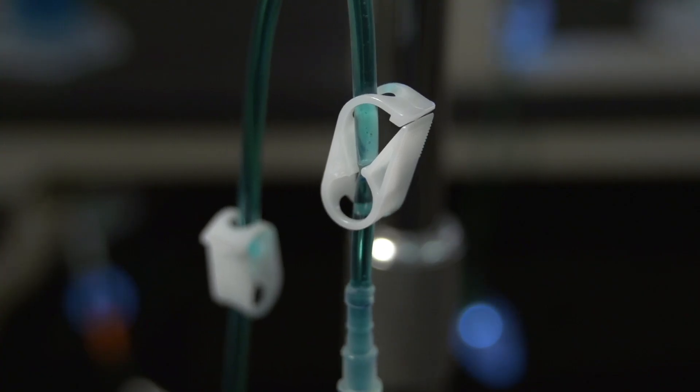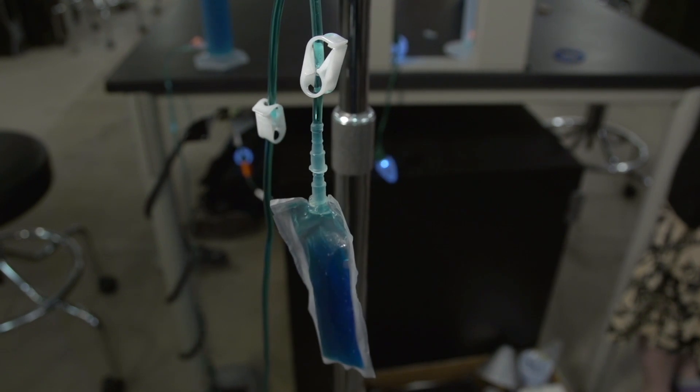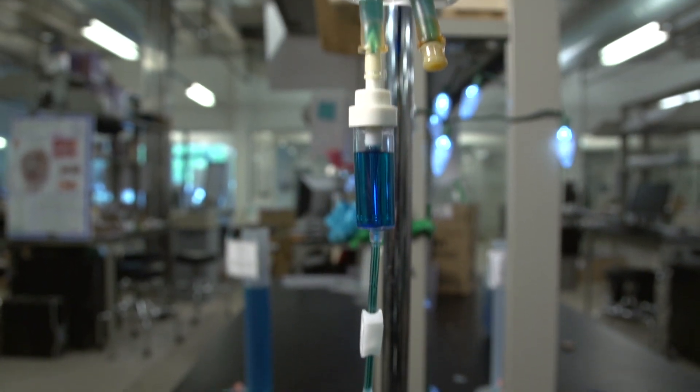We've designed the Easy Flush IV tubing set. It's modified standard IV tubing which a person would need if they're receiving IV fluids or medication, and we've added three pinch clamps, a Y connector, and a flush chamber. This allows nurses to flush through a catheter to clear it of medication or any residual blood that may be in it, and help prevent infections.